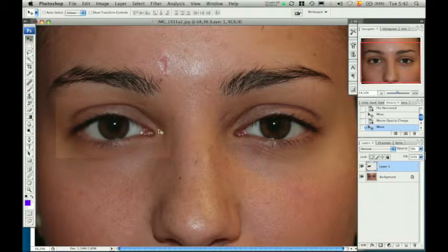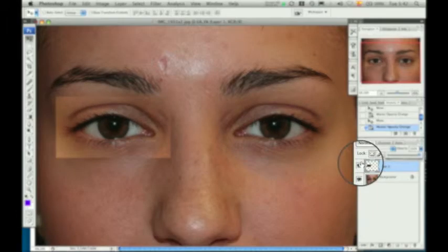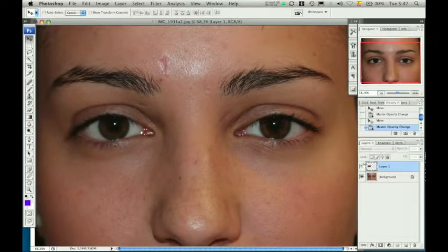After bringing the opacity back up, the superimposed eye may be toggled on and off using the layer view icon.